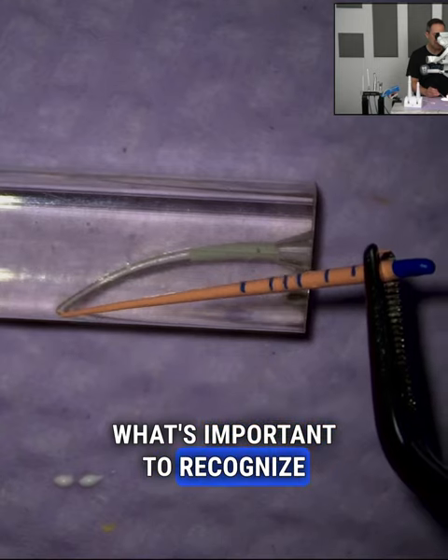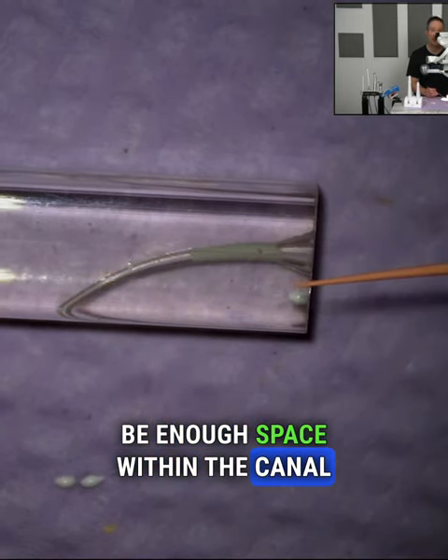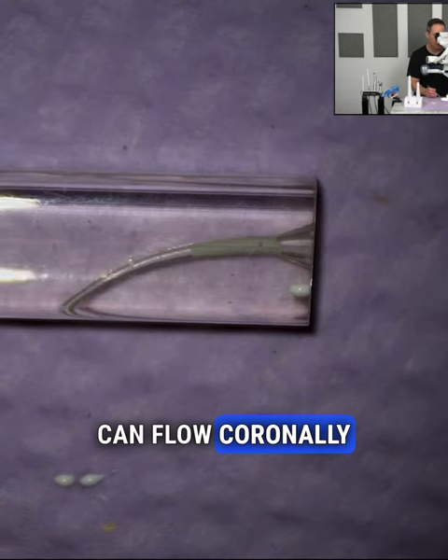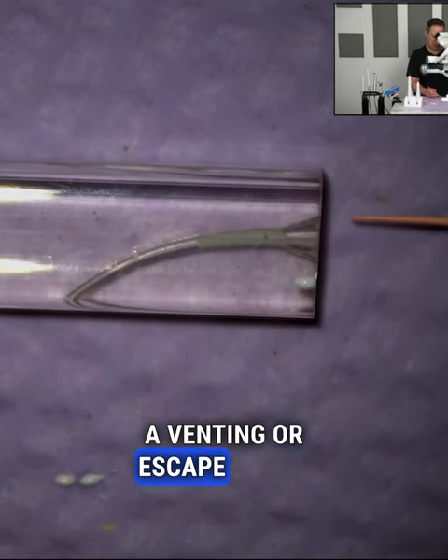What's important to recognize is you also want there to be enough space within the canal where some of the sealer can flow coronally as well. It gives it almost like a venting or escape valve.